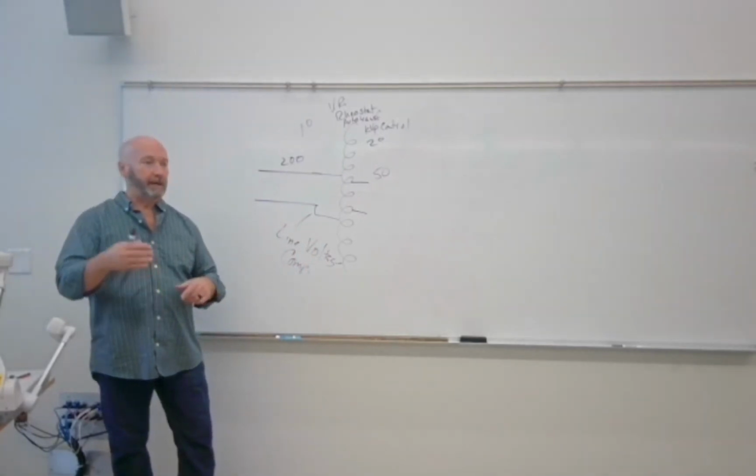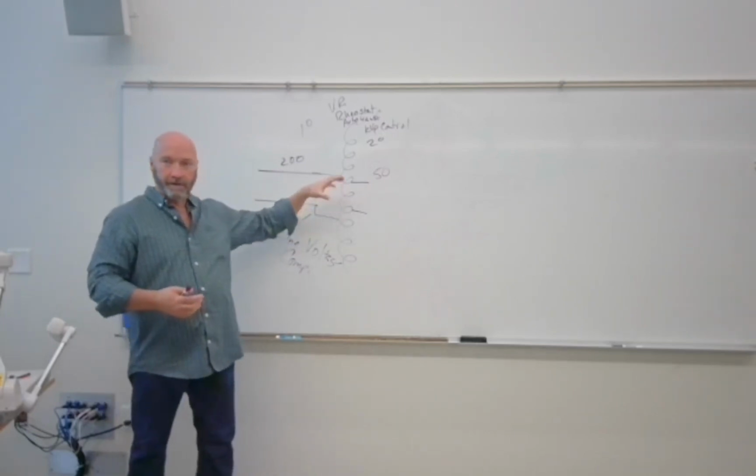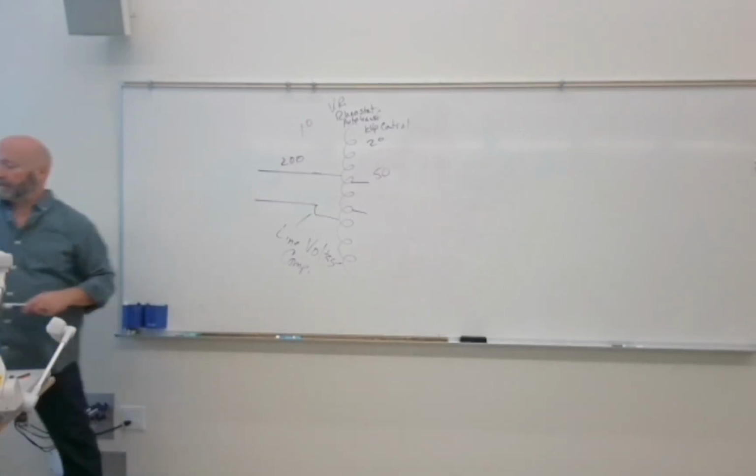So minor and major kVp adjustments, you just don't see them. You push the button and it makes those adjustments, but they're inside working on your autotransformer. Okay. So you've got the autotransformer.